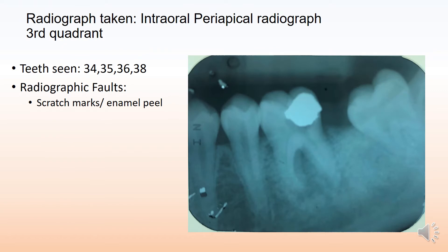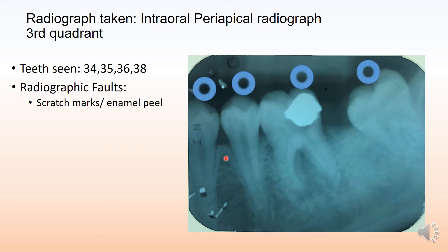Today we have a radiograph taken for the third quadrant. This is an intraoral periapical radiograph and the teeth seen are 3-4, 3-5, 3-6 and 3-8.